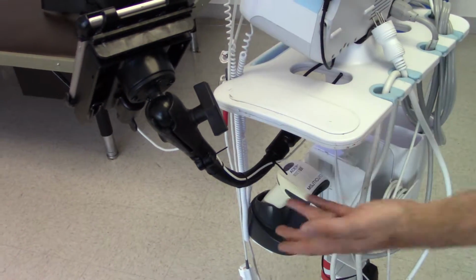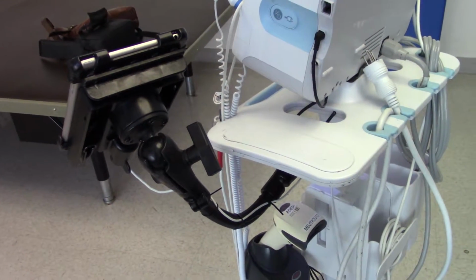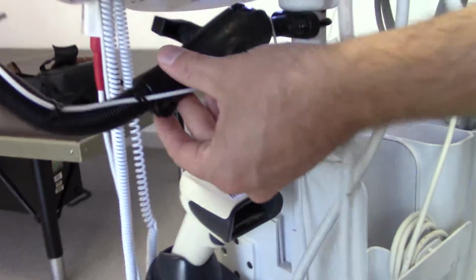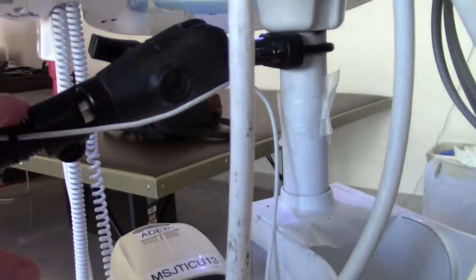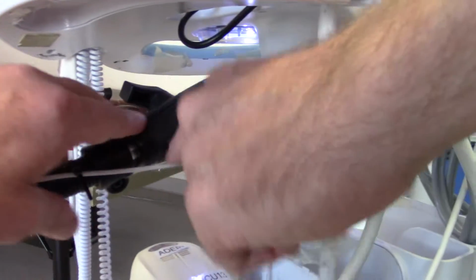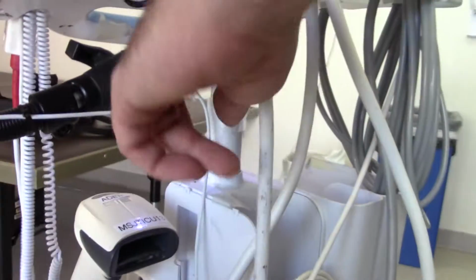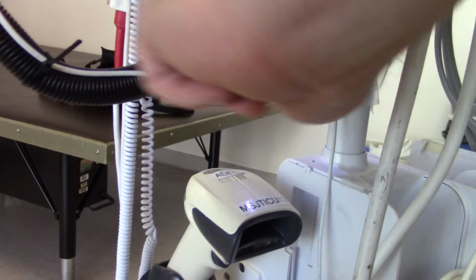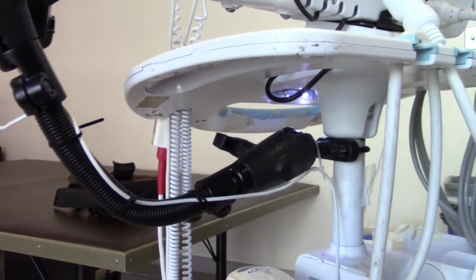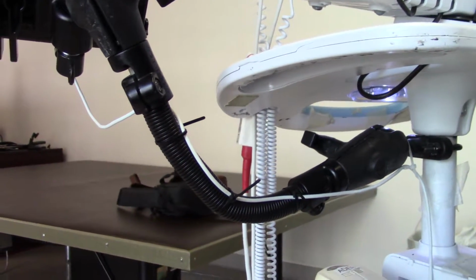No, or it actually physically breaks off, because from all the movement, either the ball wears out to a point that it's so worn down from moving that it's no longer able to tighten. Okay, so that's the actual physical break, these nylon ends break. From being impacted, and usually it cracks right in here, right where the pipe is attached between those two pieces. And if that happens, is the ball joint broken? No, the ball joint's usually okay. We just have to buy a whole new arm here. Correct. And the problem is that arm takes six to eight weeks. Yeah, my supply chain is really poor on that, so that's some of our challenge with these devices.